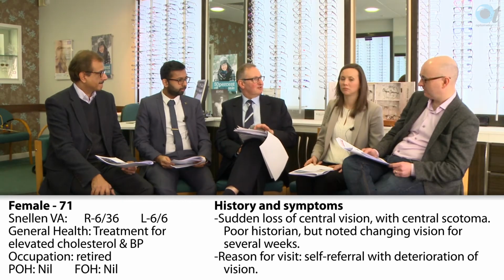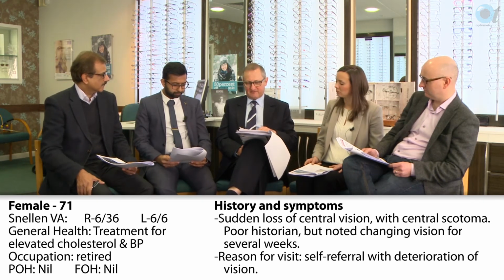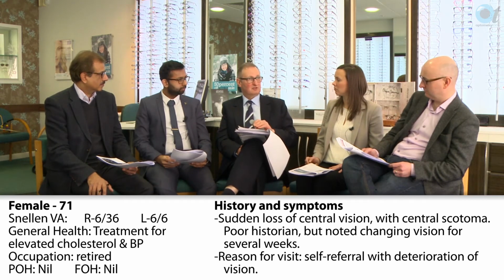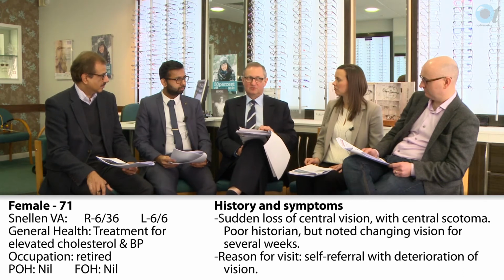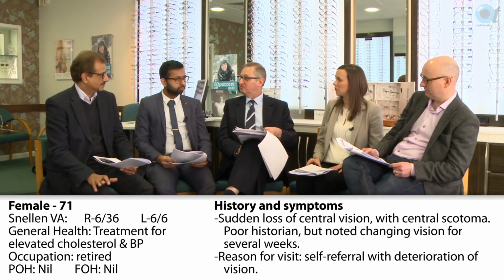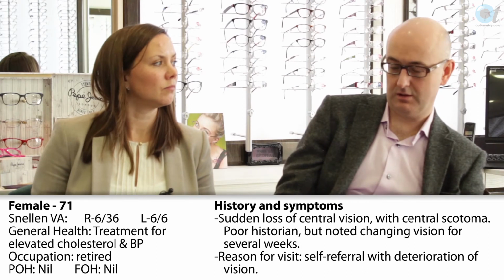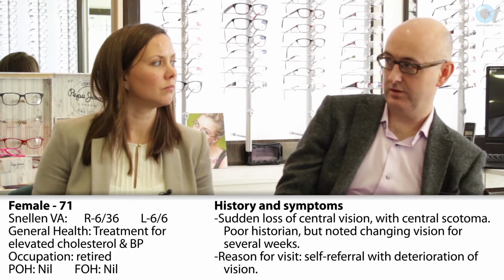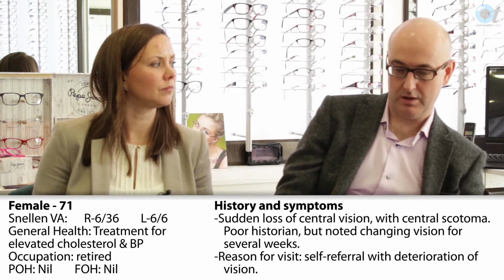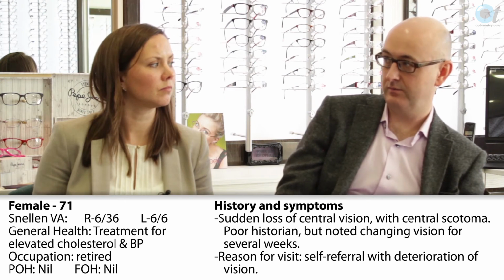Maybe we could just extend this discussion, actually, on this case. If it turned out that the left eye had a vision of 6/9 and there was definitely macular thickening on the OCT due to traction, would that alter the management that the ophthalmology team might have, and therefore the advice that you might be giving her in terms of what to expect? There are treatments now to attempt to dissolve the tractional forces with a drug. So it'd be perhaps wise, and comforting perhaps, to tell the patient that there are treatments for this in the fellow eye.